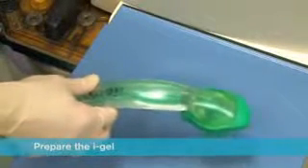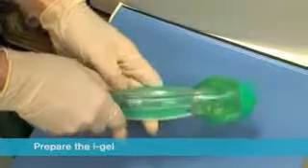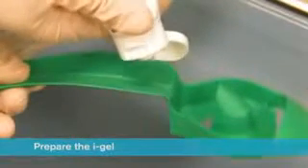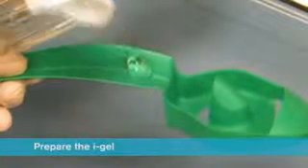Ensuring that you conform to local policy for hygiene, open the iGel package and on a flat surface take out the protective cradle or cage pack containing the device. In the final minute of pre-oxygenation, remove the iGel and place a small bolus of a water-based lubricant such as KY Jelly onto the middle of the smooth surface of the cradle or cage pack in preparation for lubrication.